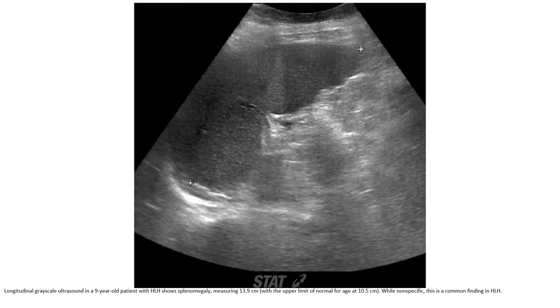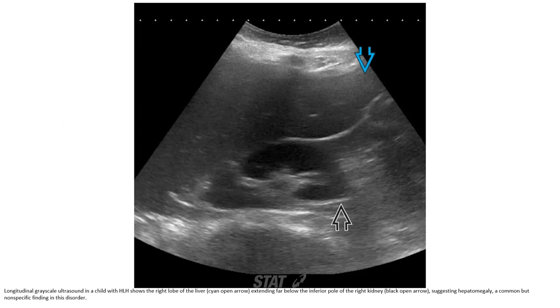Grayscale ultrasound in a nine-year-old patient with HLH shows splenomegaly measuring up to 13.9 cm, while non-specific splenomegaly is a common finding in HLH. Grayscale ultrasound in another child with HLH shows the right lobe of the liver extending far below the inferior pole of the kidney, suggesting hepatomegaly, a common but non-specific finding in the disorder.